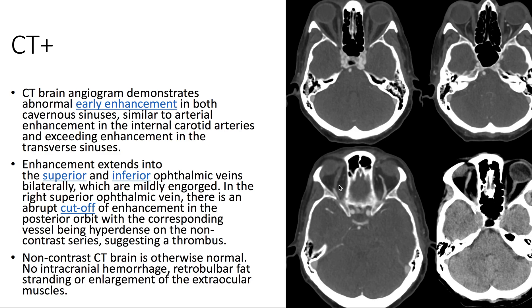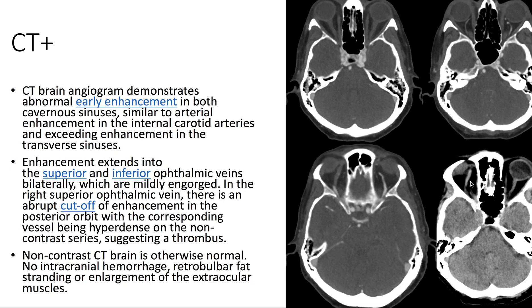However, here on the right, we see that there's an abrupt cutoff of enhancement, which corresponds with the vessel being hyperdense on the non-contrast series, suggesting a thrombus.